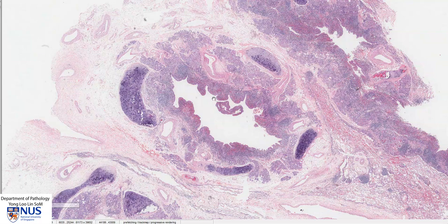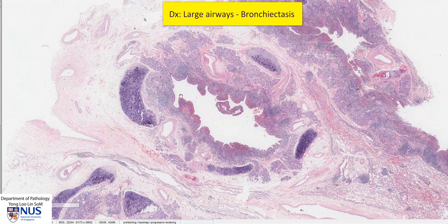Hello, this is a virtual microscopy slide of a case of bronchiectasis. We are looking here at a bronchus. Bronchiectasis is a condition where there is permanent dilatation of the bronchi and bronchioles due to destruction of the smooth muscle as well as elastic tissue in the wall, and this is usually secondary to persistent infection.